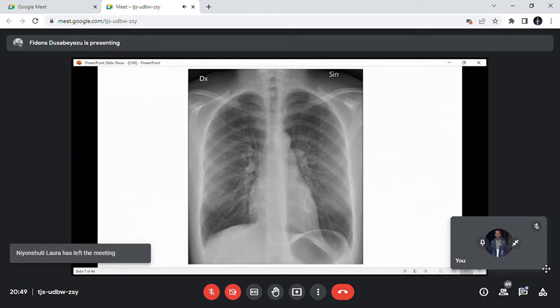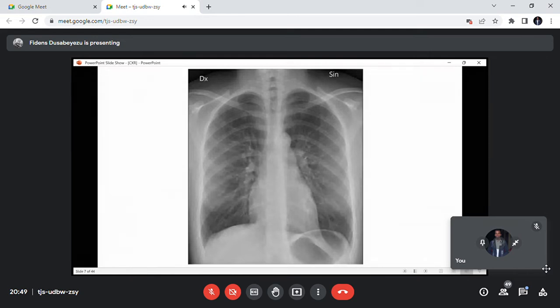But also here, I cannot just continue without telling you that some diseases and conditions require a doctor to request a chest radiograph in an expiratory phase, not inspiration. For example, if you have a patient with suspected foreign body aspiration, you have to request a film in expiratory phase so that we see what we call air trapping.